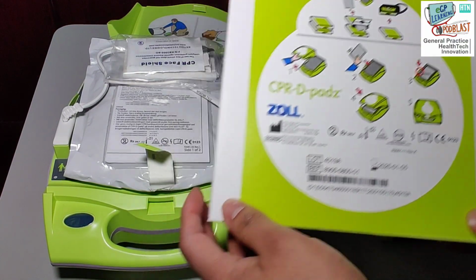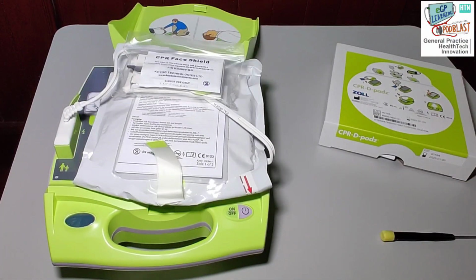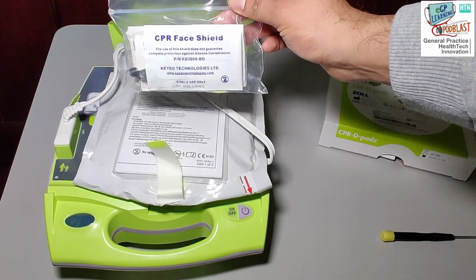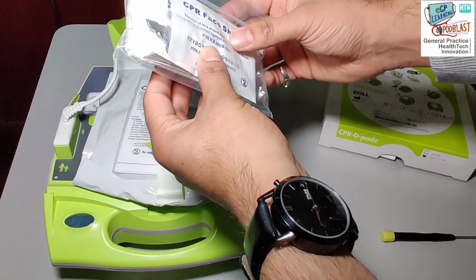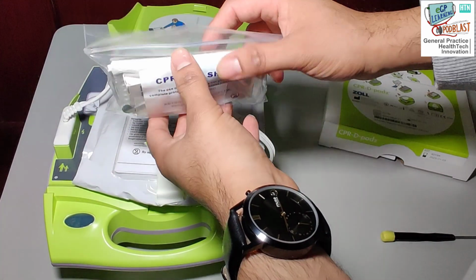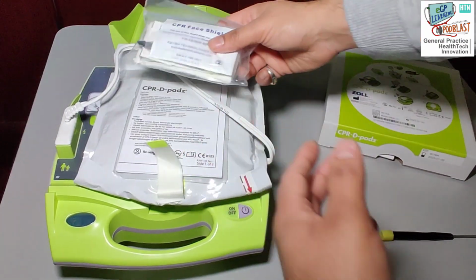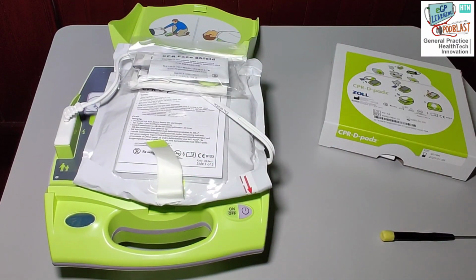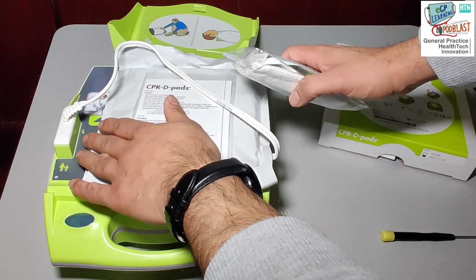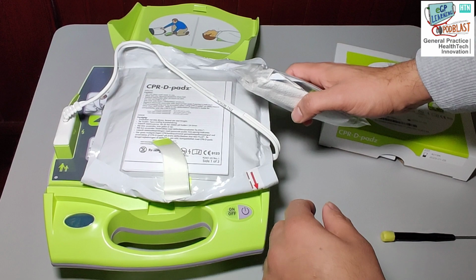Open the pads pack. If we have a look at the pads in more detail, you can see that there is an extra pack that comes with it. This includes various items such as a pair of scissors, face mask and cleaning kit in case you need to shave them or do other things in order to make the pads usable. The pads themselves are sealed and come with a cable that, as you can see, inserts into the machine.